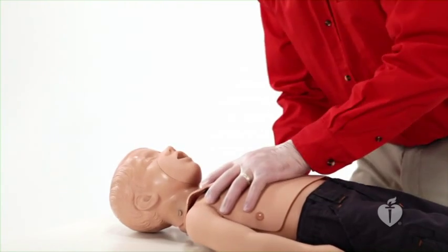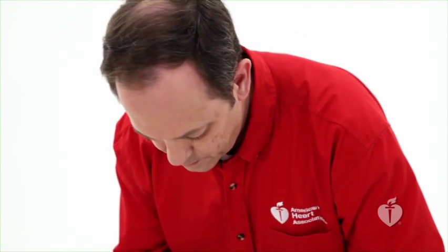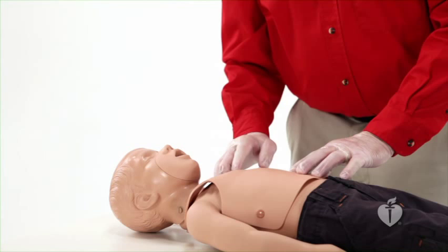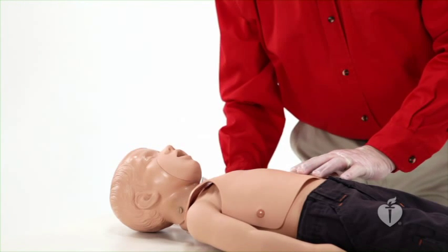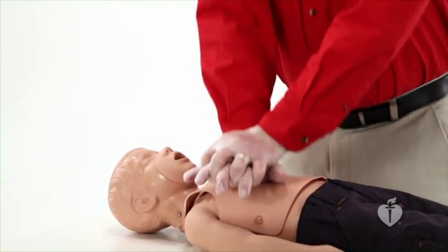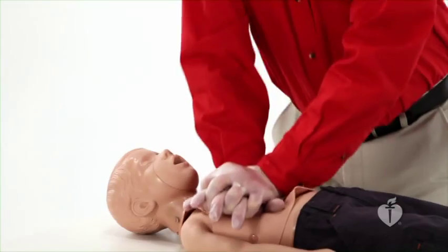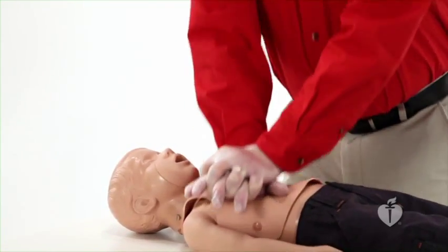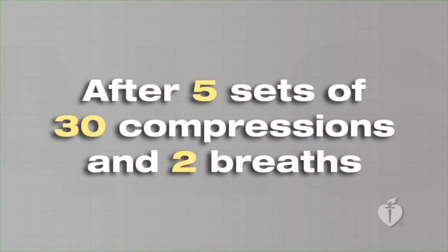Hey, are you okay? It's not responding. It's not breathing. You activate the emergency response system and bring an AED back. There's no pulse.